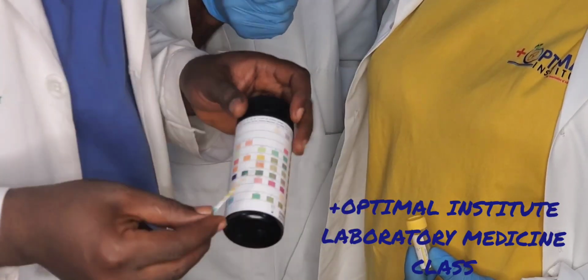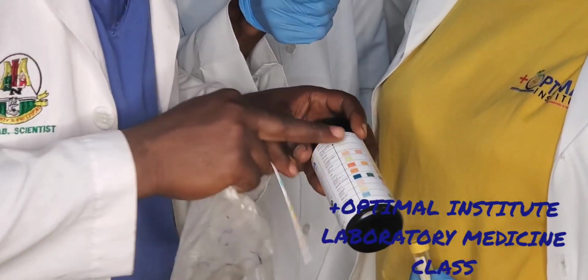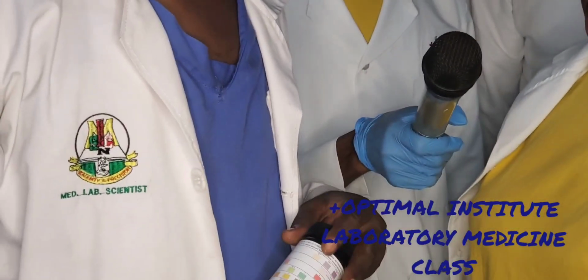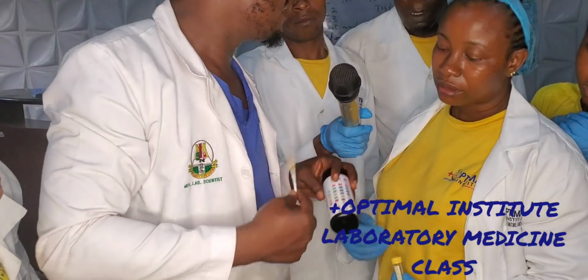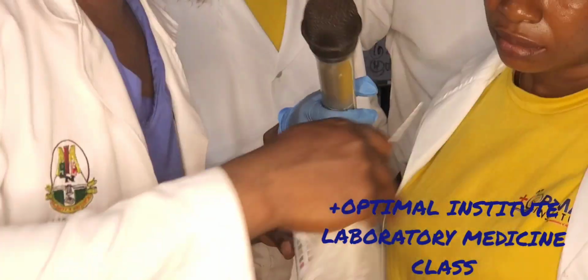Except for two: pH and specific gravity. You must not take the first color for these; you must take from the second color till the last color. Why? Because their negativity is from the back. For SG it is from the back, and for pH from the second.